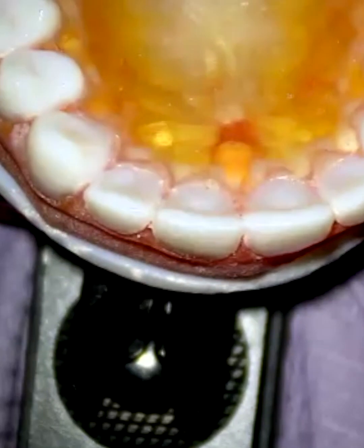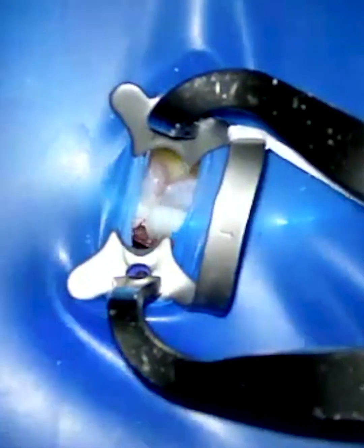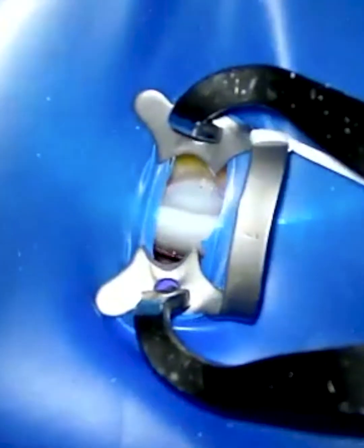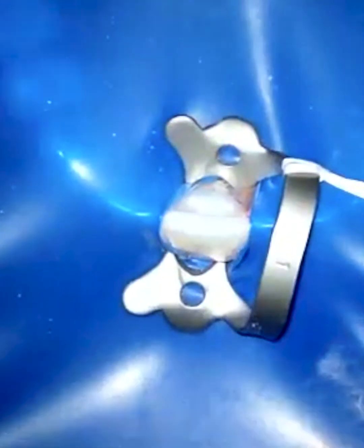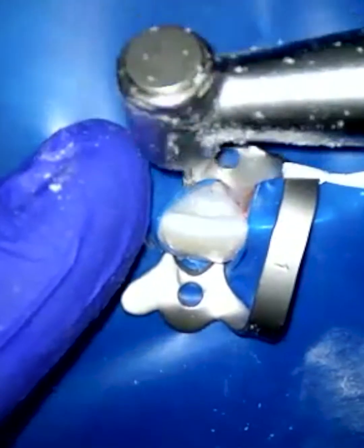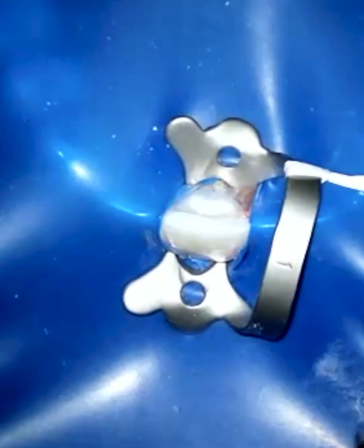Now look at what it looks like with the rubber dam on. When you put the rubber dam on, you always want to scan and take a look — I know this is the canine, this is the lateral, central right here, here's the other central. But now look at what happens with the rubber dam on: I have lost the ability to see the neighboring teeth. However, if I studied it without the rubber dam first, then once the rubber dam goes on this picture looks a lot clearer.